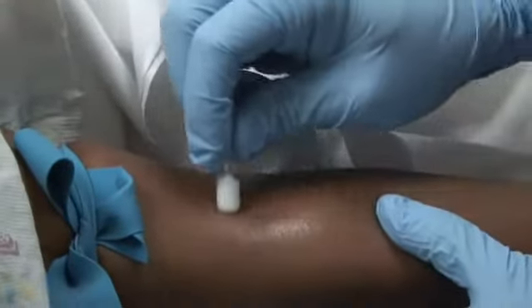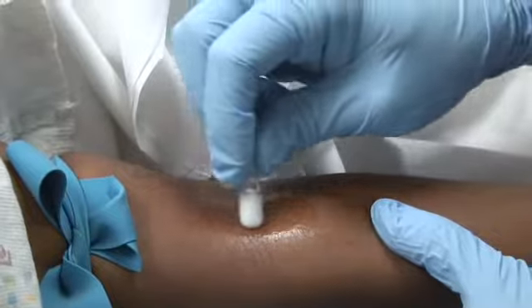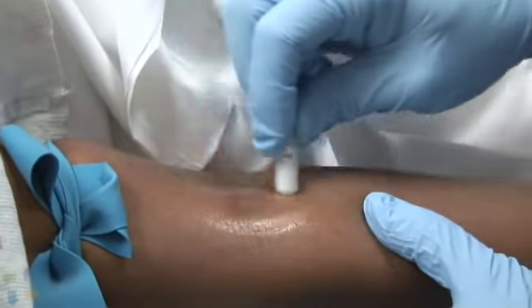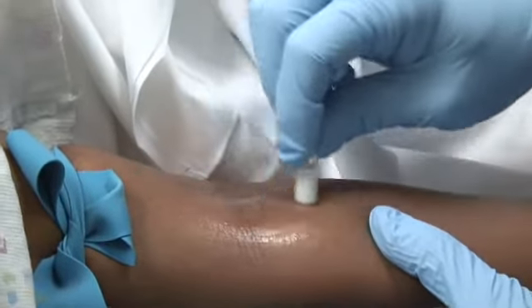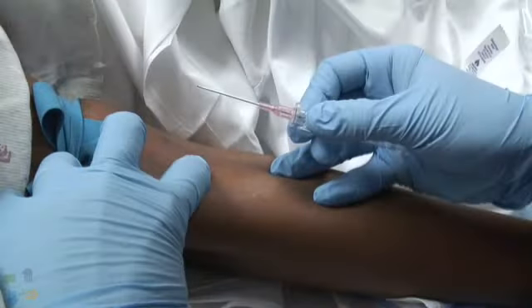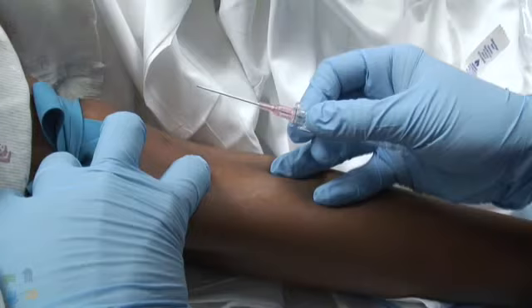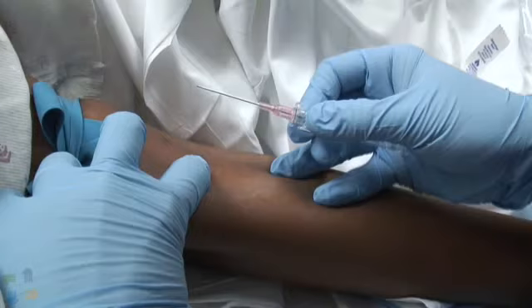Once you have found an appropriate site, clean the area with an antiseptic swab. Stabilize the vein with your thumb and forefinger, as veins have a tendency to roll away from the approaching needle.